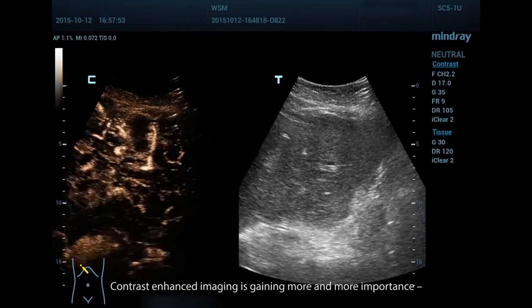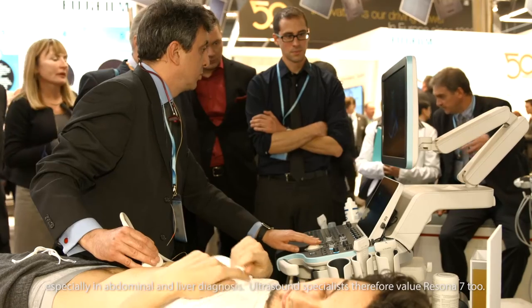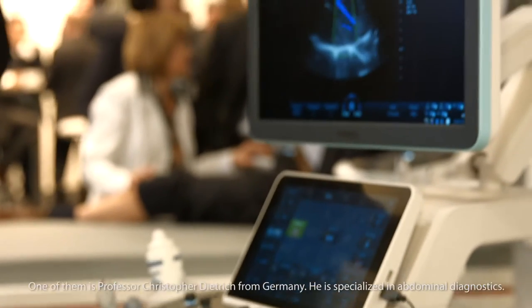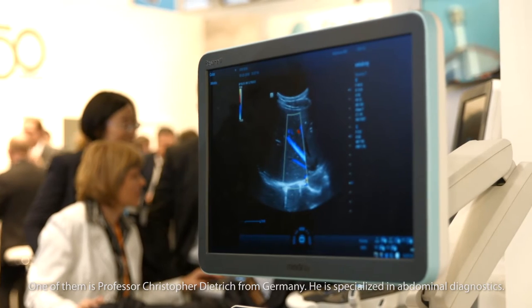Contrast-enhanced imaging is gaining more and more importance, especially in abdominal and liver diagnosis. Ultrasound specialists therefore value Resona 7. One of them is Professor Christopher Dietrich from Germany, who is specialized in abdominal diagnostics. The Mindray Resona 7 system allows reliable ultrasound imaging using contrast-enhanced ultrasound technique.